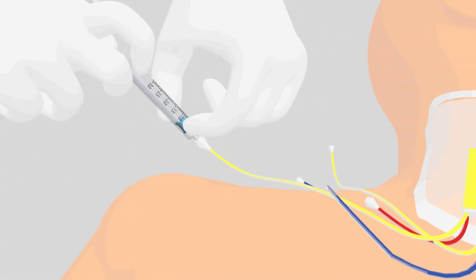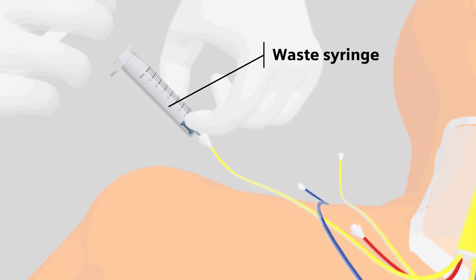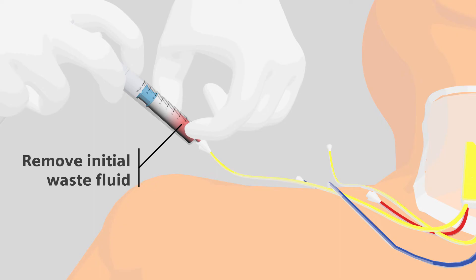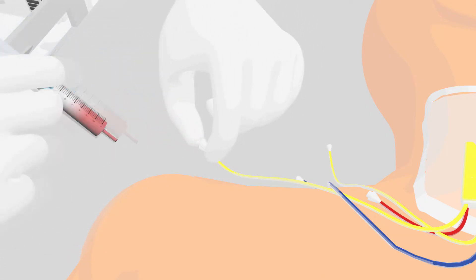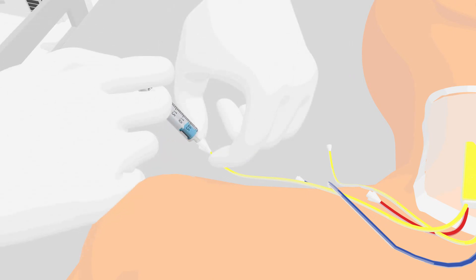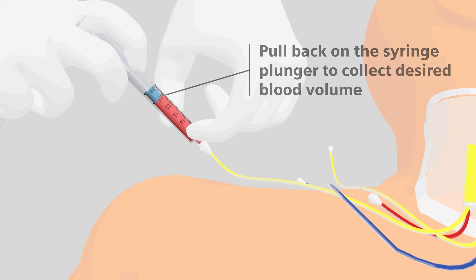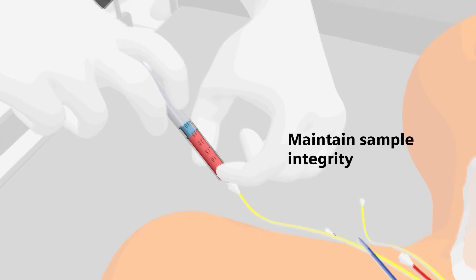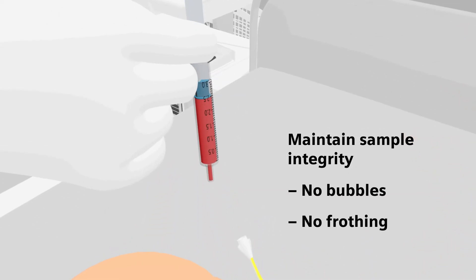Perform a saline flush and attach the waste syringe and remove the initial fluid from the central line or the pulmonary artery catheter. The amount of fluid that needs to be withdrawn varies with the line system used. Remove and discard the waste syringe. Attach the heparinized syringe to the line cannula port and slowly withdraw the desired volume of blood from the patient. Once the desired amount of blood is obtained without bubbles or frothing, remove the syringe from the line cannula.